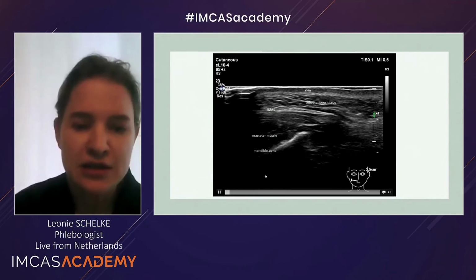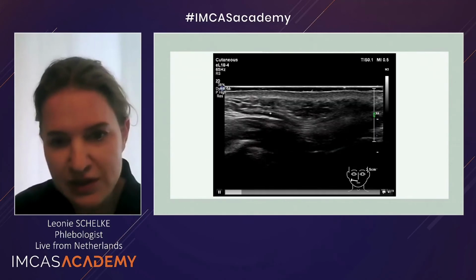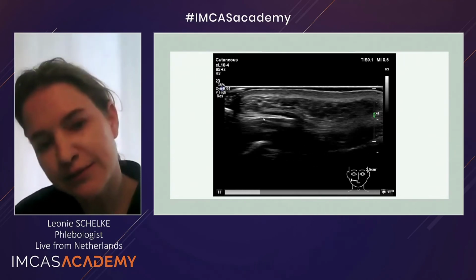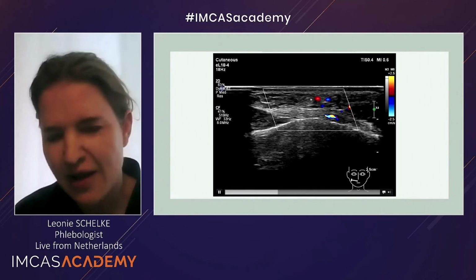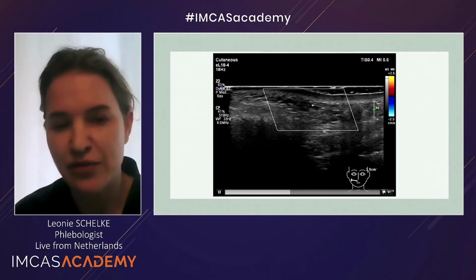Somewhere you will see my cannula coming in. Here it comes from this area, from the left side. No, this is just me showing the subcutaneous fat pad. I'm always checking for vessels, are there any variations in my way before I inject? There you saw a small artery pounding, but not really that special.